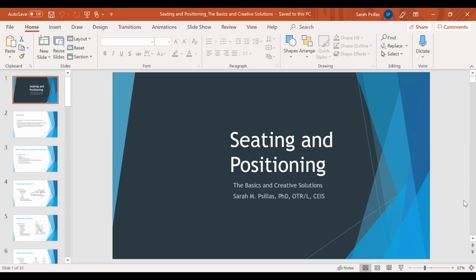But that's it so far. Do you have any rules or regulations on what that measurement should look like, if you have the option to give different sizes? Or do you do it by looks? No, we do a complete assessment. We need to know what their condition is, how they possibly got their injury, and what their home is like in terms of the kinds of surfaces they have and their doorways.